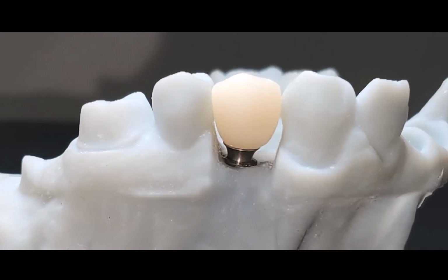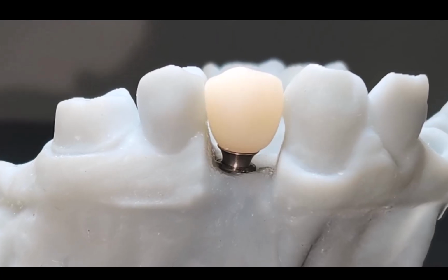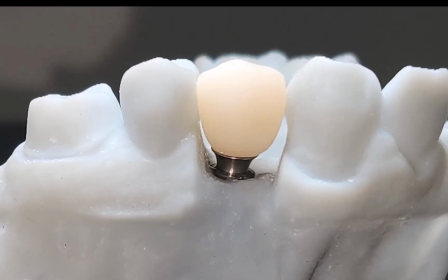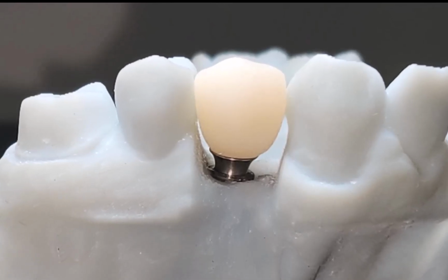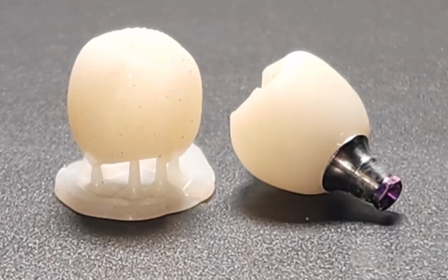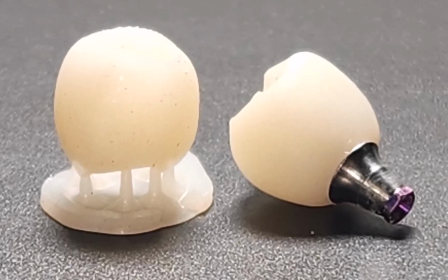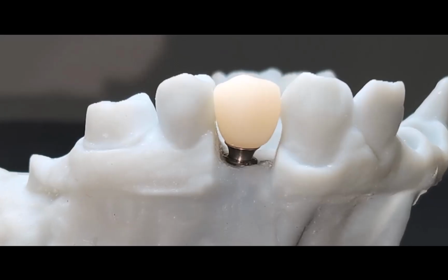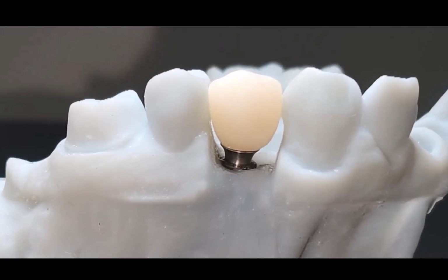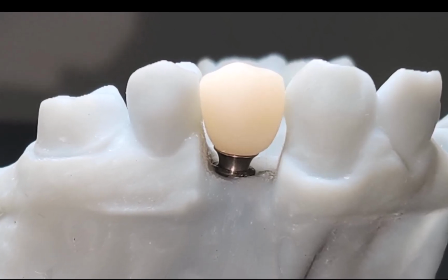Same thing if you get an Emax or a zirconia crown milled. But this makes for a really great restoration. And again, I hope that it was helpful to see this entire process all the way through, from the planning of an implant and creating a guide to using Scannable Healing abutment and just really appreciating all the way through. This is something that the average doc can do. It's not that complex. And once again, you do have LabPronto as a resource to delegate out any or all portions of this process if you don't want to do it.